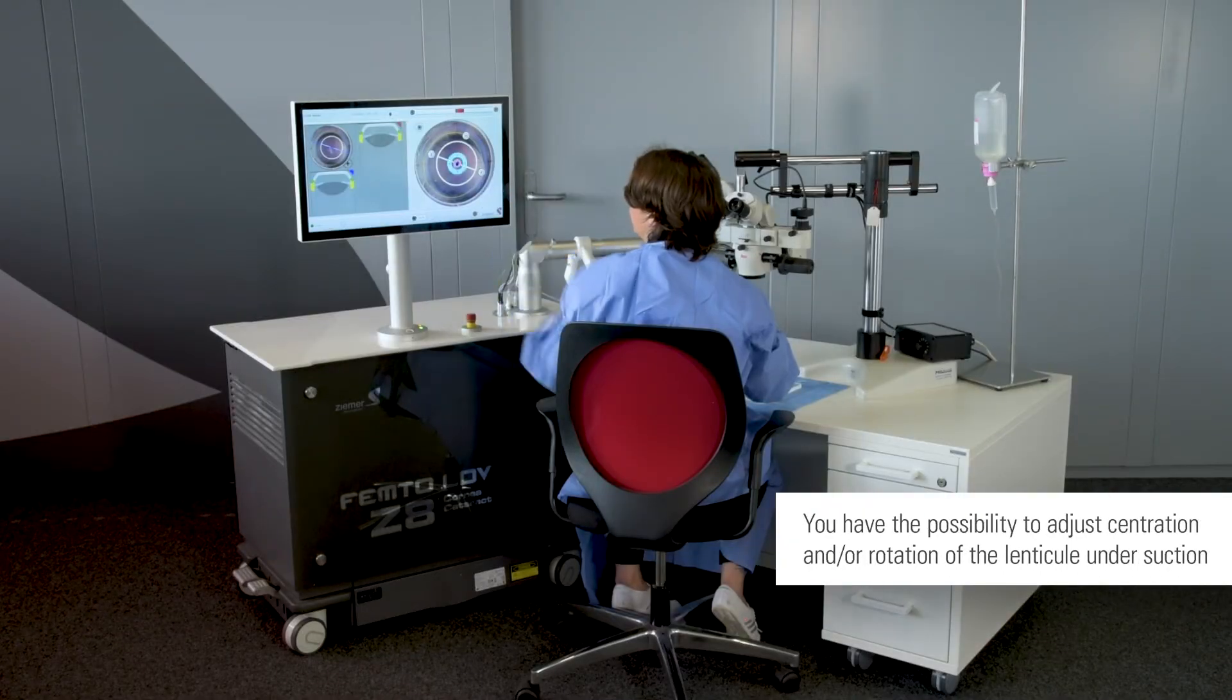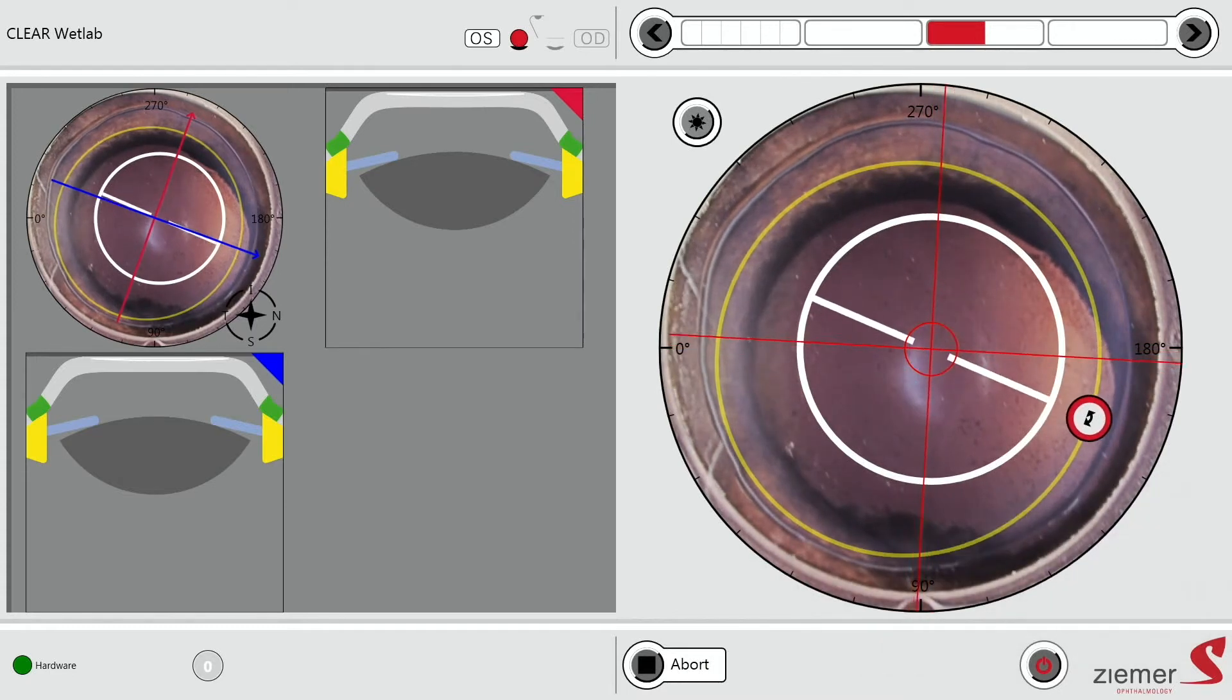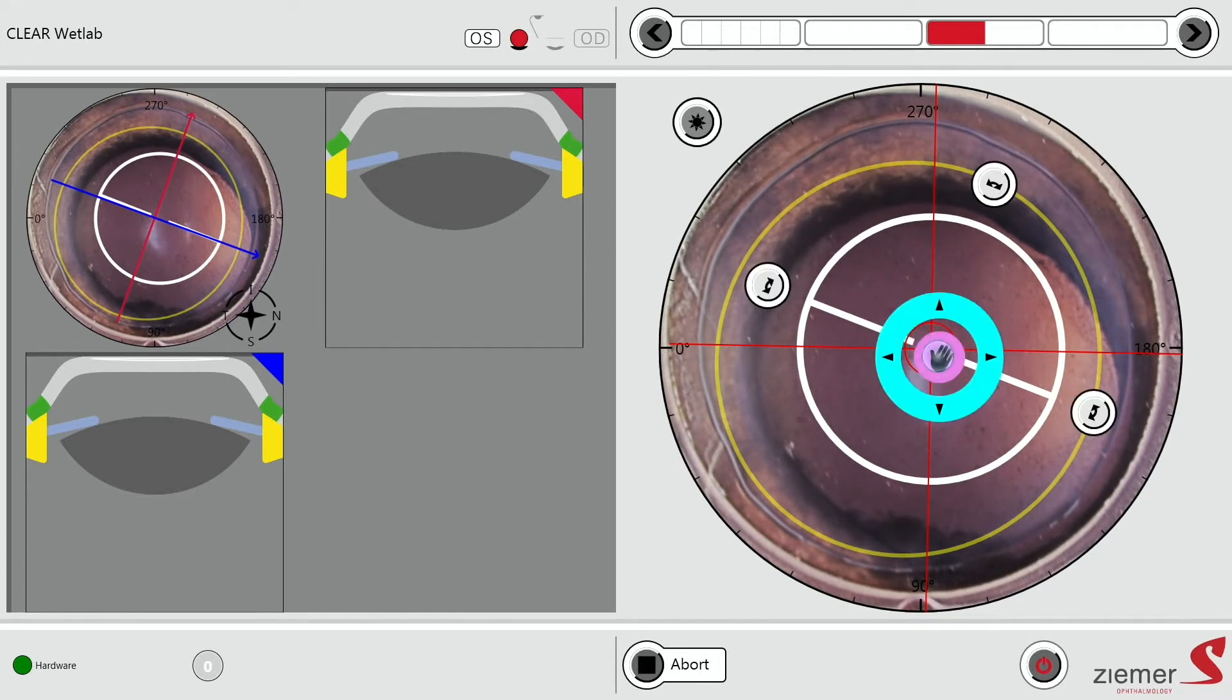Here we offer the advantage that under suction, you can still make some modification with the positioning, with the angle. So you can also compensate here some torsion that you like or recenter.